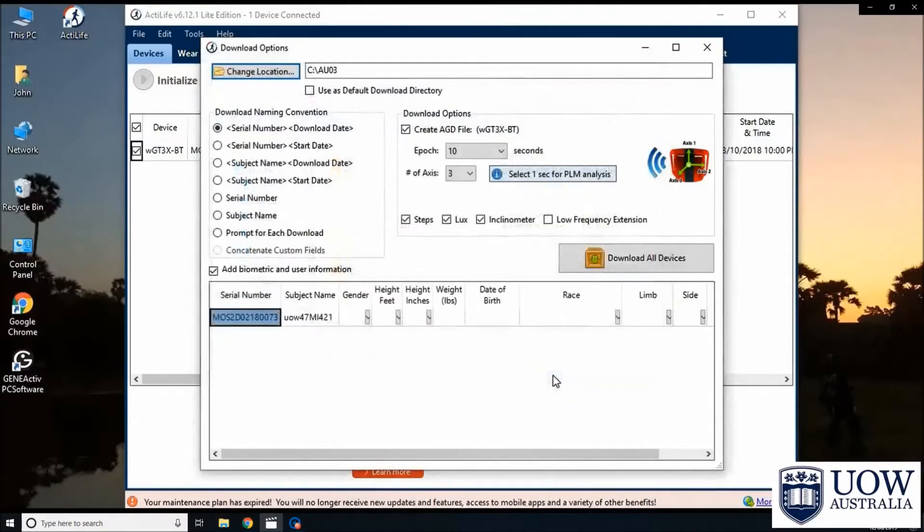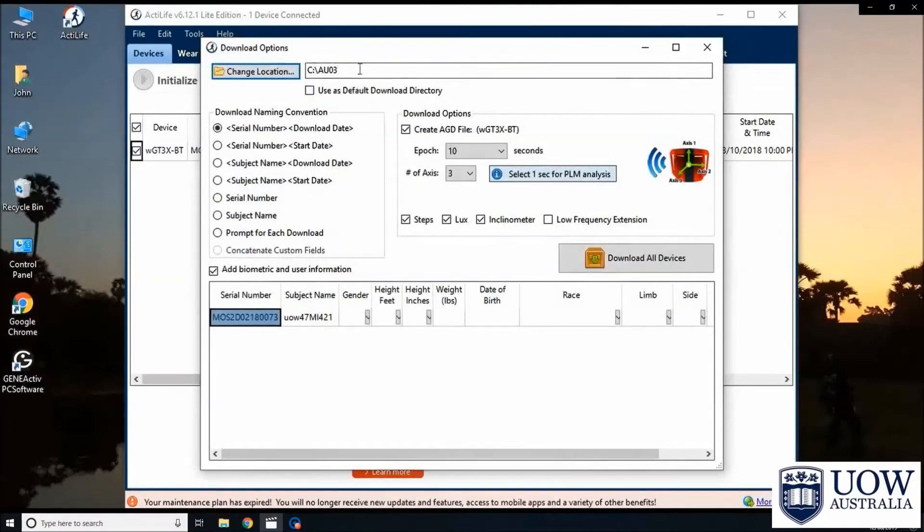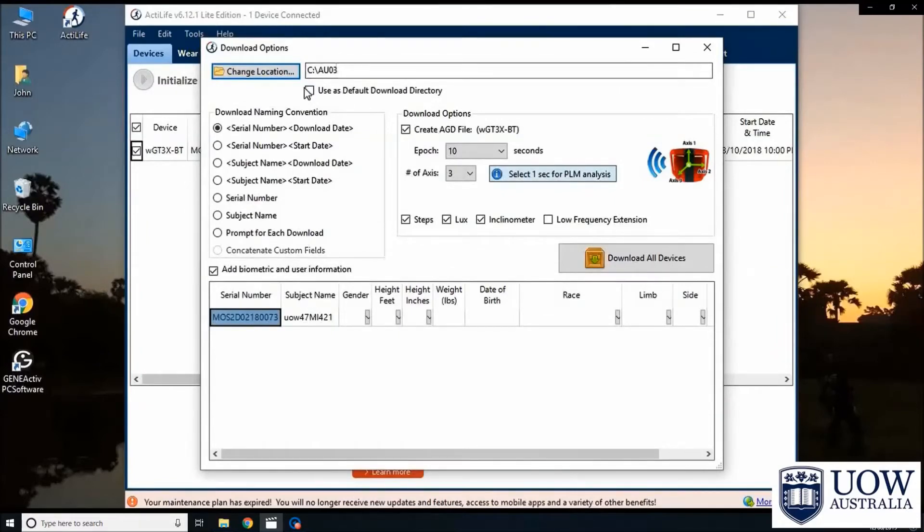The selected folder location will now appear as the download directory. We recommend using the same folder to save all the data. To do this, simply check the option to use this folder as the default download directory.